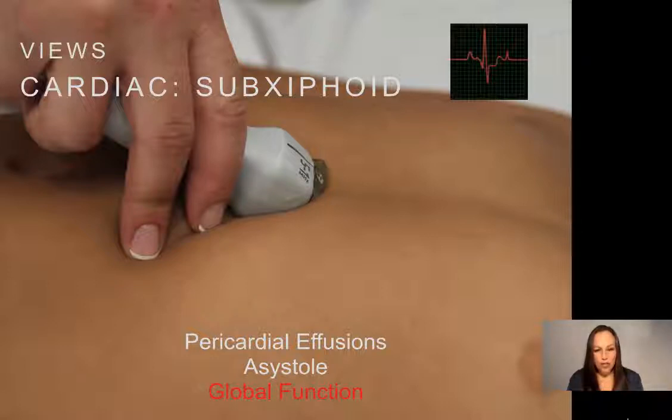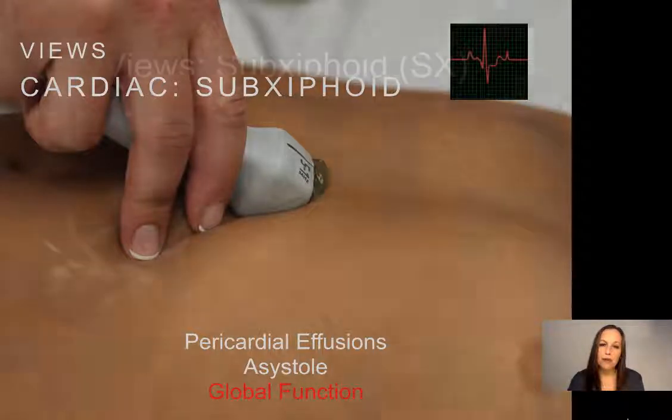Now, in the traditional RUSH protocol, they describe the views of the heart as being the parasternal long axis and the apical four-chamber views. This has since changed slightly, and I would say that in pediatric patients, the preferred views could be subxiphoid and parasternal long axis views. Now, you may be familiar with this subxiphoid view, as this is the preferred view in the FAST examination. We can easily look for pericardial effusions. We can assess for asystole without interfering with compressions on the anterior chest, and we can evaluate for global function. This is considered a four-chamber view.